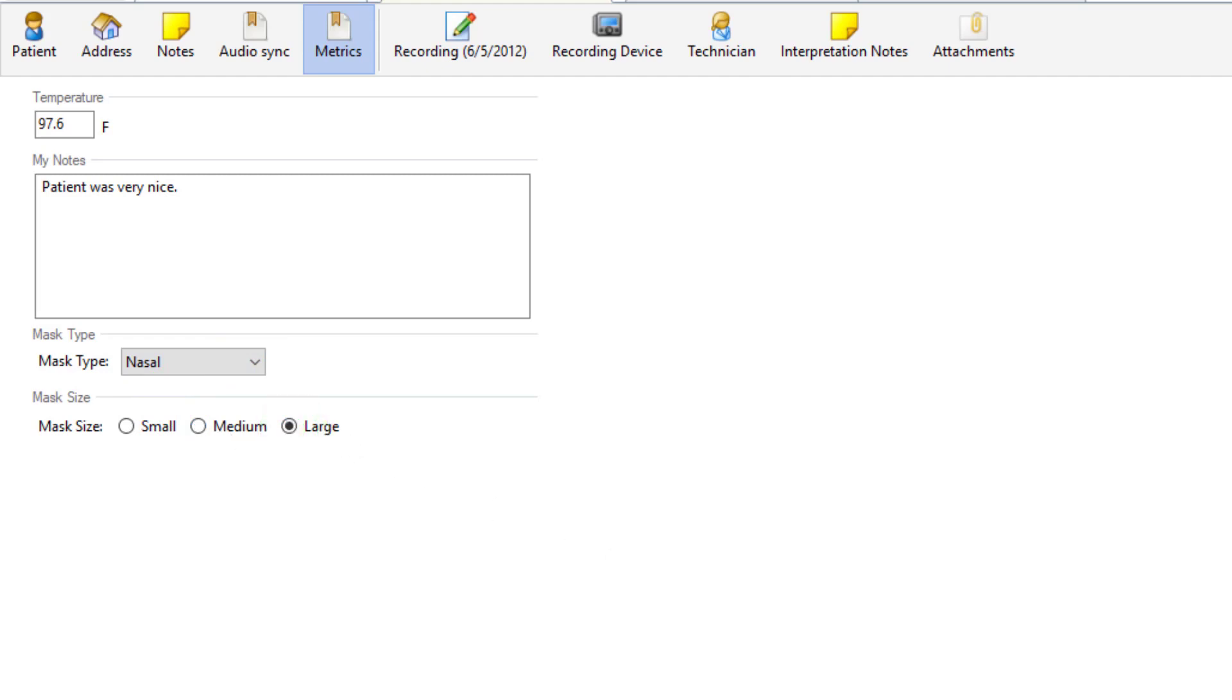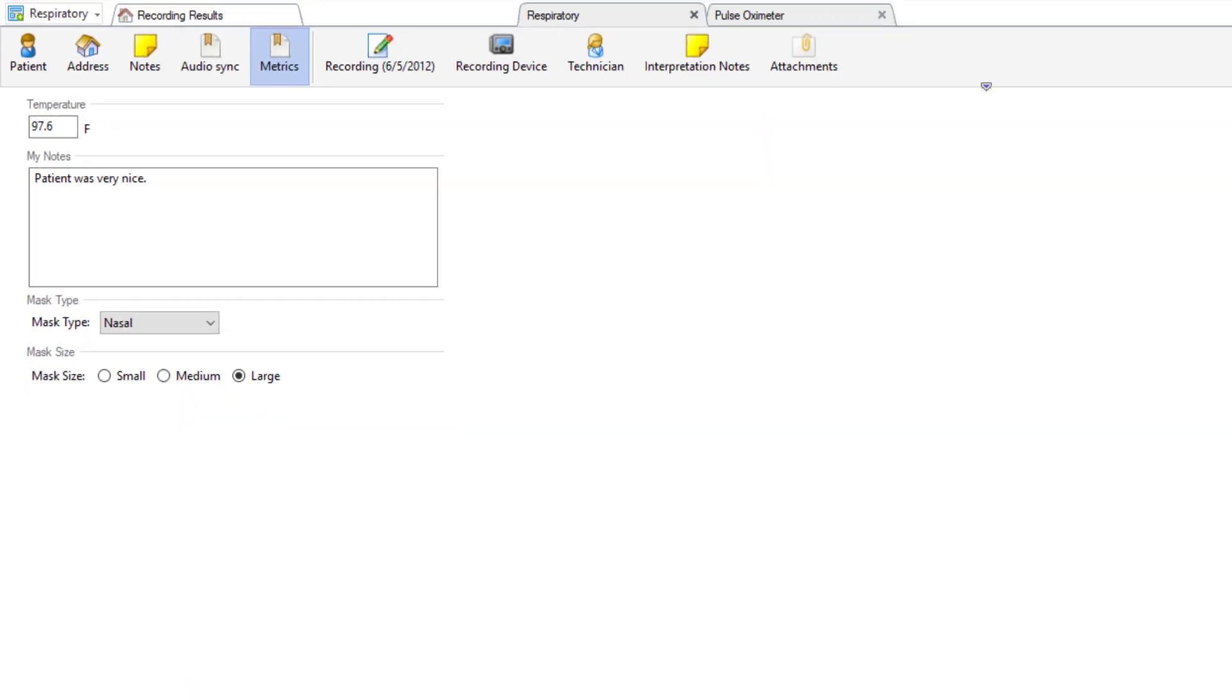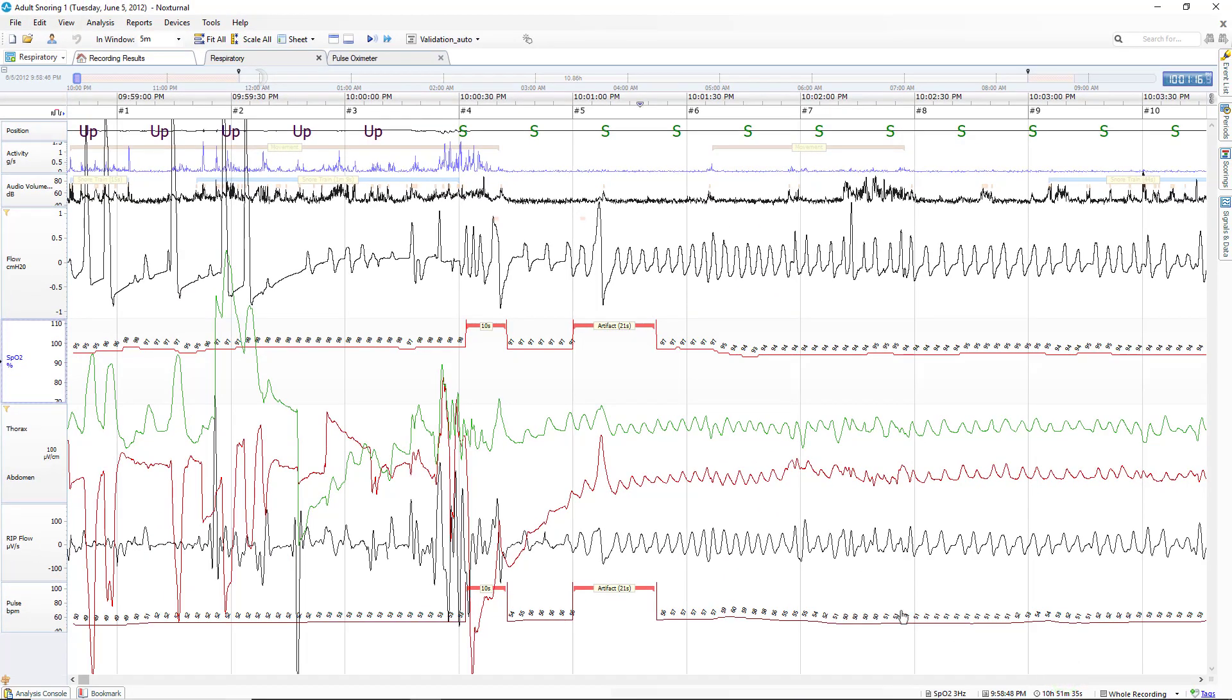Click OK. And this information has been saved to this patient's folder. This information can also be used for custom reports or interpretation notes.